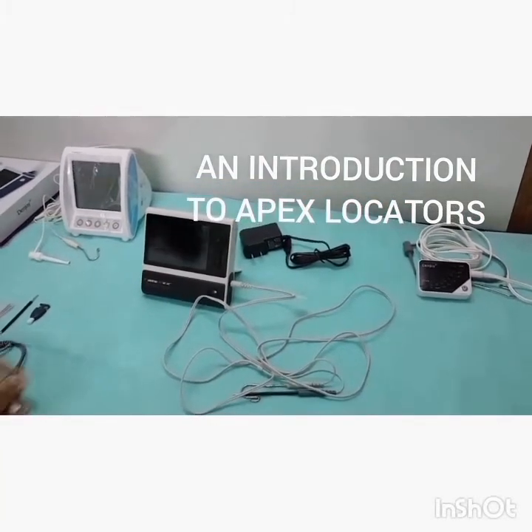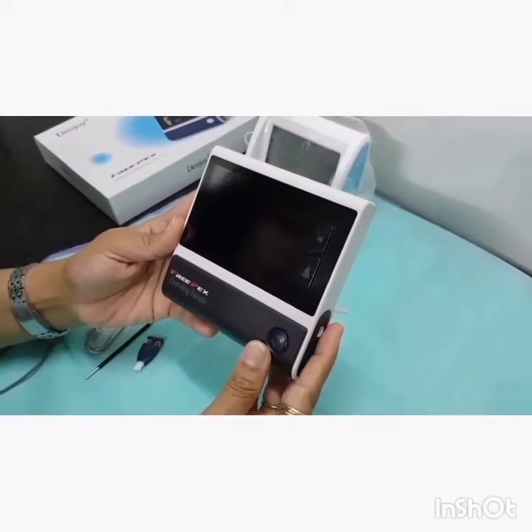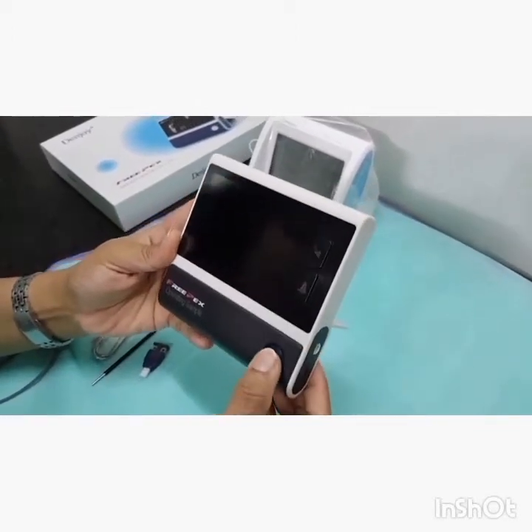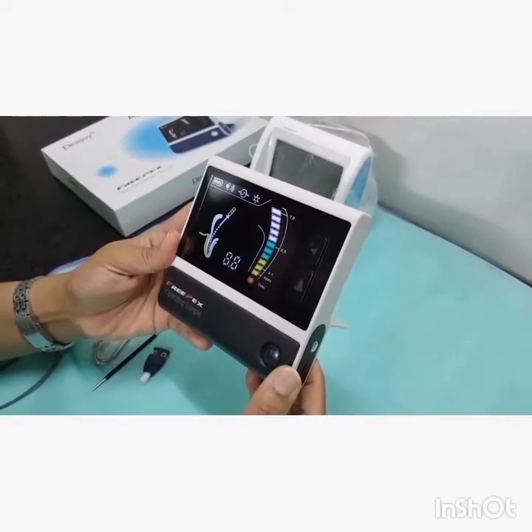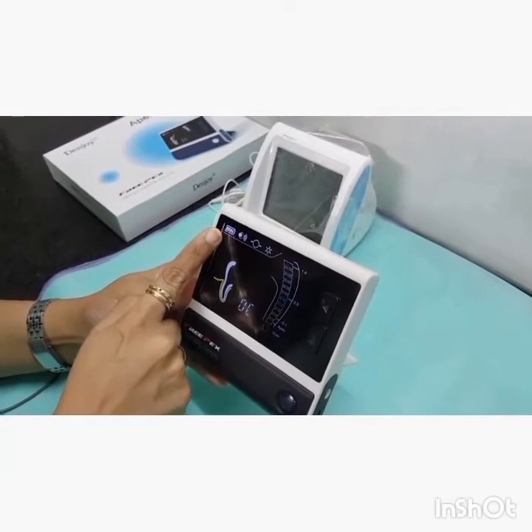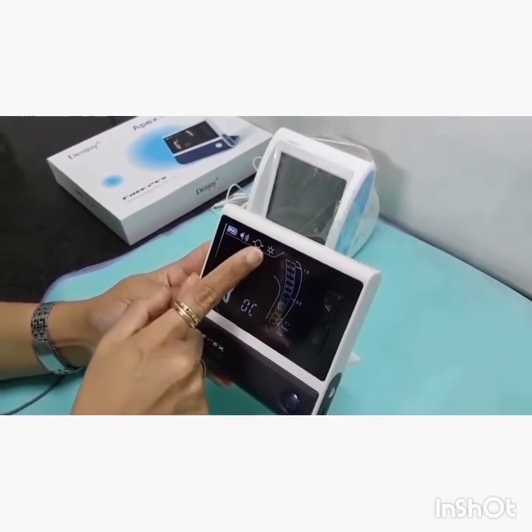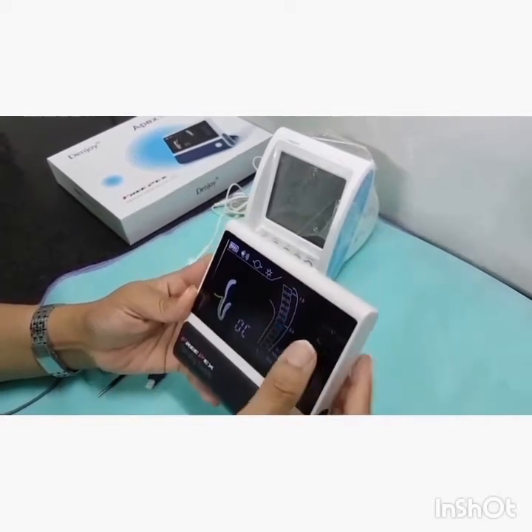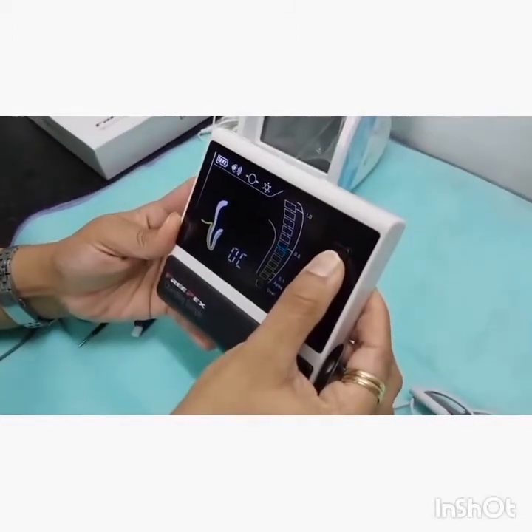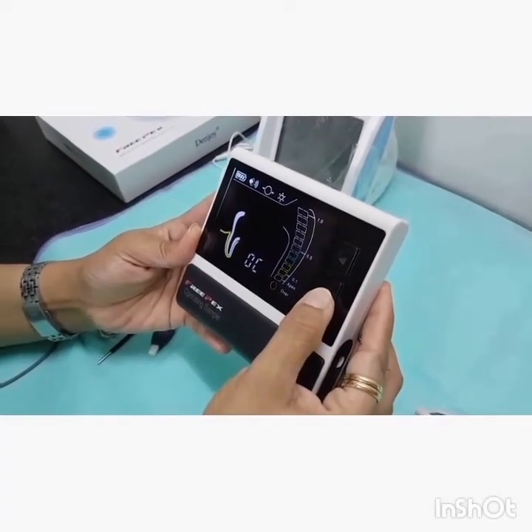Let us see how to operate an apex locator. Here we have a tabletop apex locator. This is the start switch, which shows you the display and the power. This indicates the volume and the brightness. The knobs here are to adjust the settings for working length determination, and this knob is to adjust the volume.